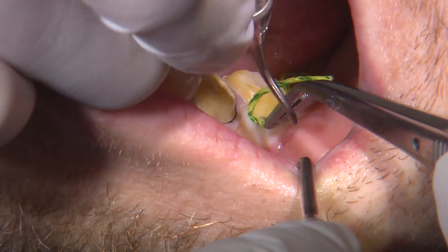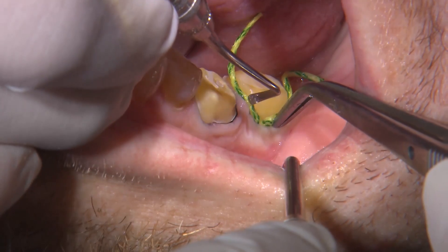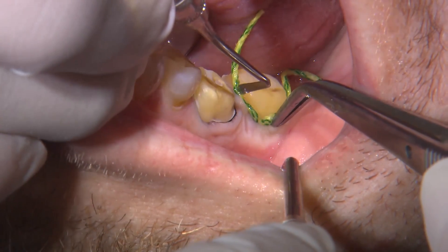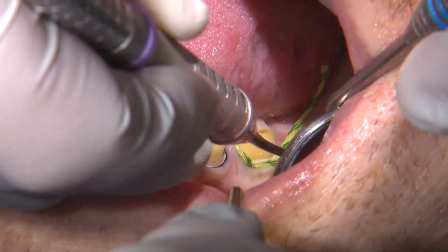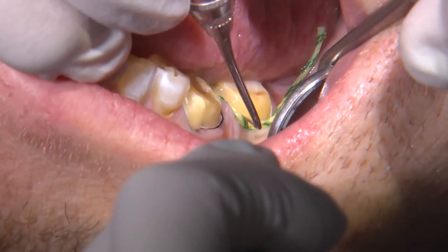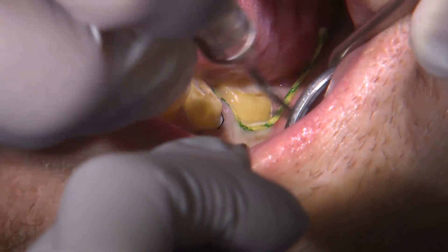We need to create some form of separation — not just for digital dentistry, but in dentistry in general. If you're doing it conventionally it's extremely important, and even more so whenever you are scanning chairside and milling these restorations in your office, because now you are responsible for finding those margins.